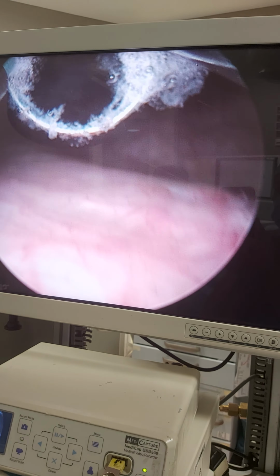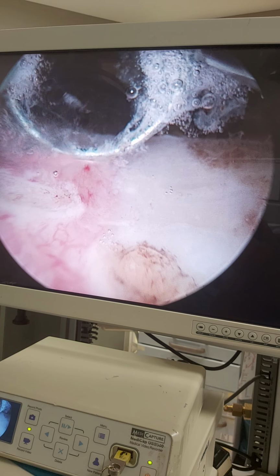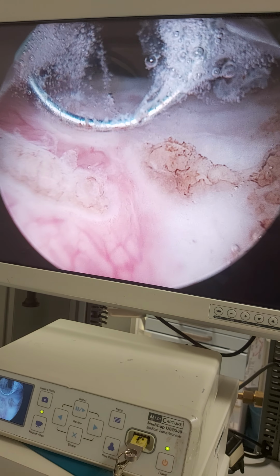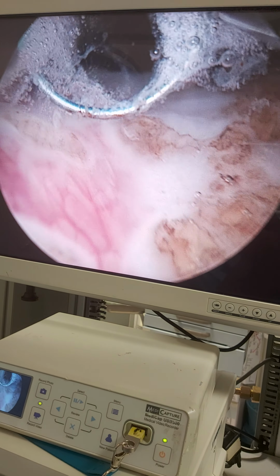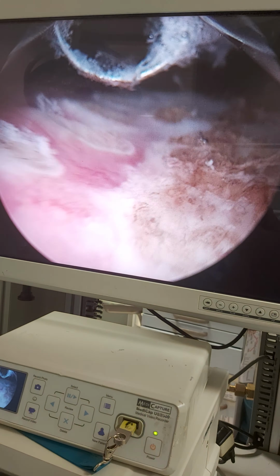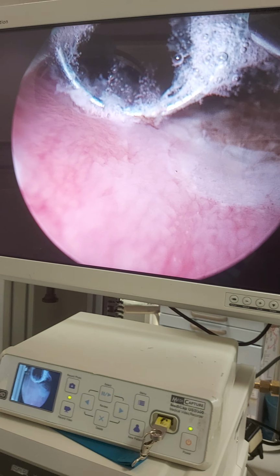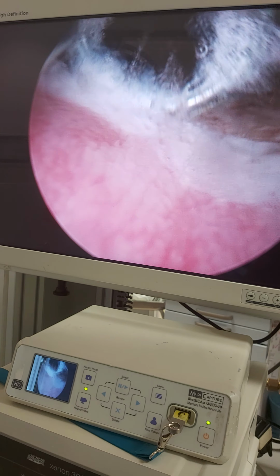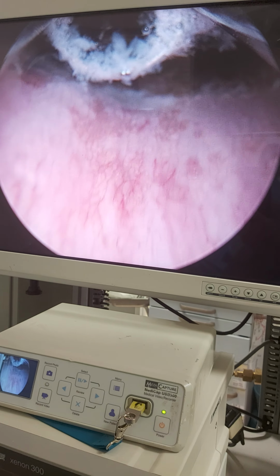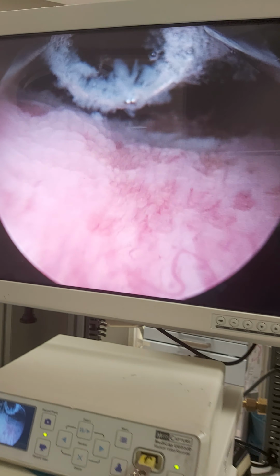Yes, we are nicely and slowly filling in the empty spaces. We are connecting the dots and try not to leave any part. Okay, you see, I want to fulgurate all these parts. And when you come to bladder neck, it's always like a horror movie. Too much.